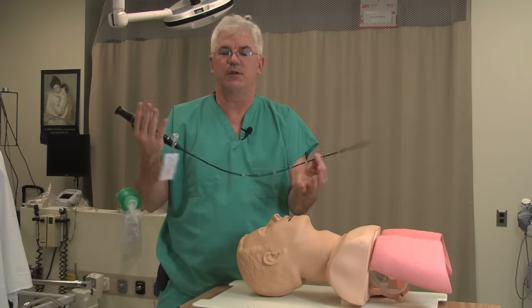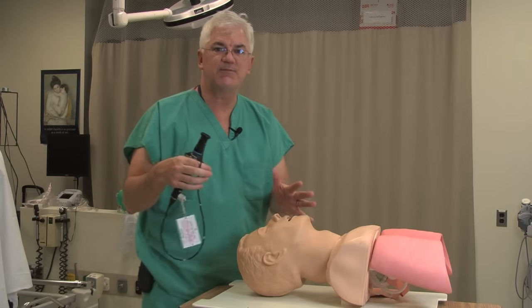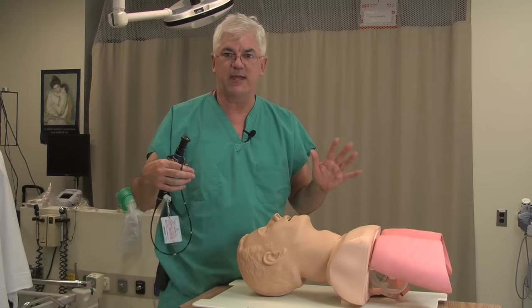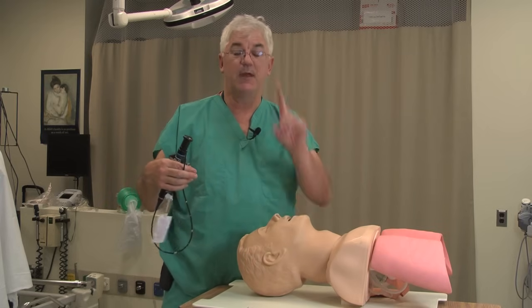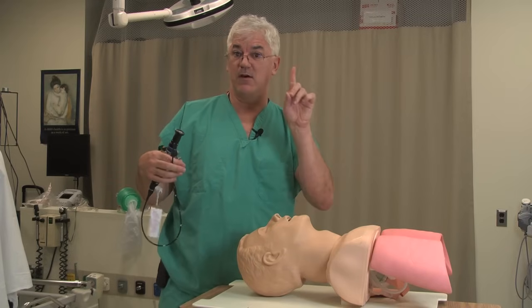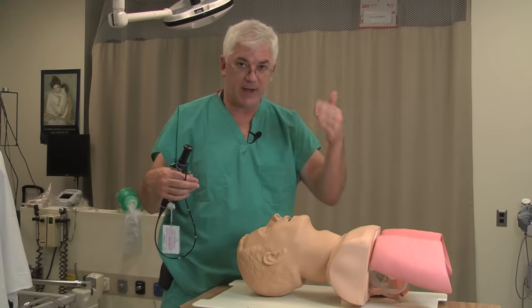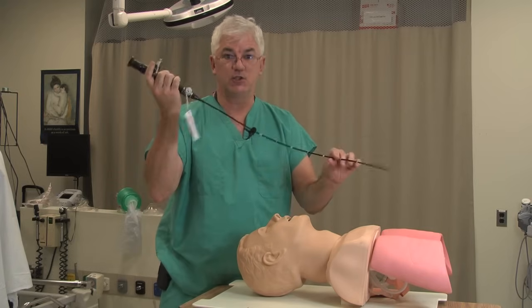So let's say we've decided to do an awake fiber optic. I've done all the good things: explaining to the patient, sedating them, topicalizing them, making sure I gave an anti-sialogogue. Make sure you give something like glycopyrrolate to dry the patient up — you don't want a lot of secretions in the airway. Now it's time to actually do the fiber optic.